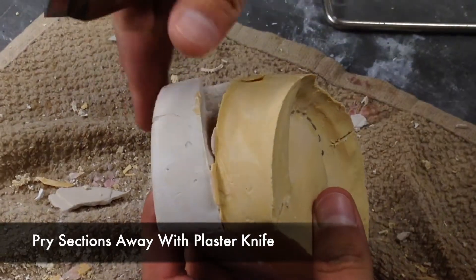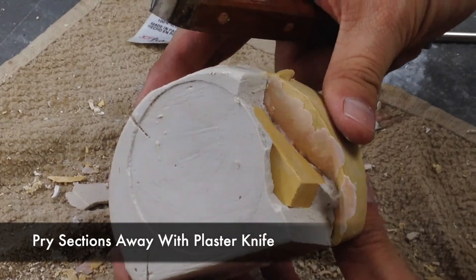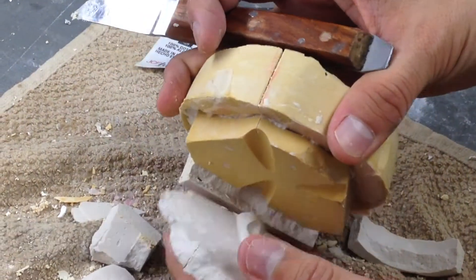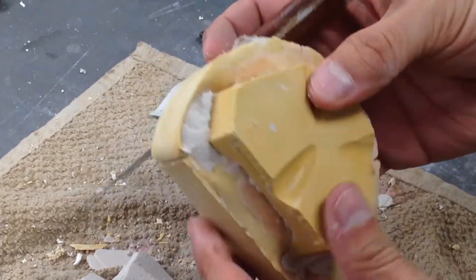Once the cuts have been completed, using a plaster knife you can pry away the sections. If the cuts are too deep, you run the risk of damaging your denture base or denture teeth. And if the cuts are too shallow, the stone will not pry off with ease.